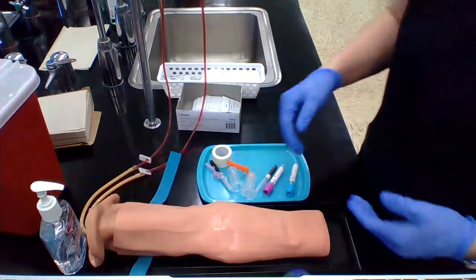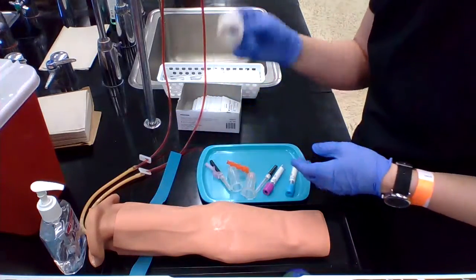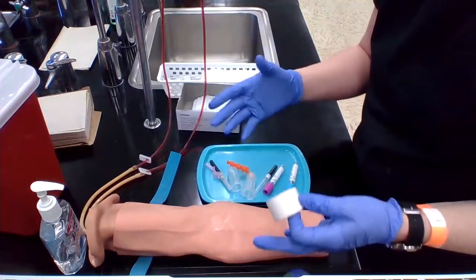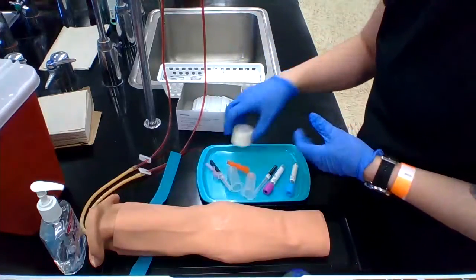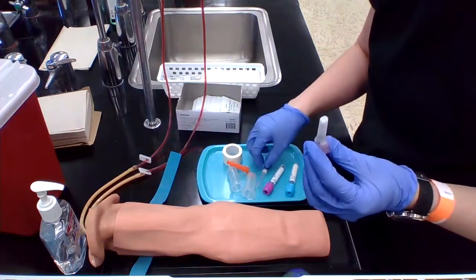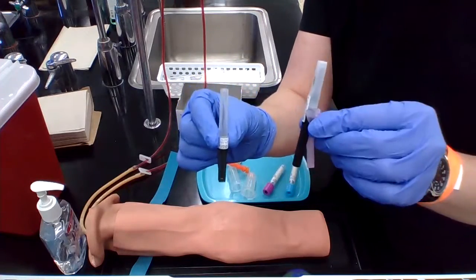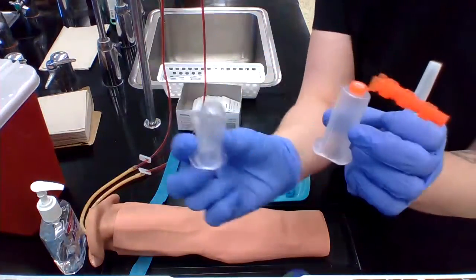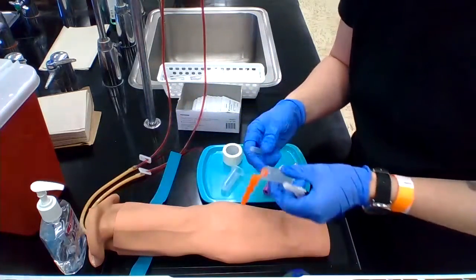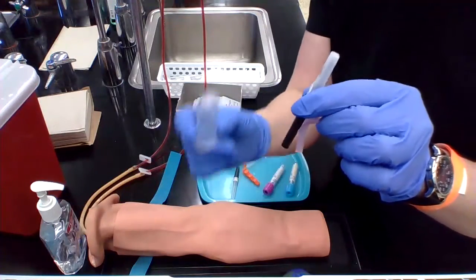While your patient is drying — remember the tourniquet is off at this point — you're going to want to assemble your materials. I like to take a piece of tape and have it ready on my tray before I do the draw, so it's just there and ready. You're going to want to get your needle and your vacutainer holder ready. These are two different types of needles — one has a safety, one doesn't. And here are two different types of holders — one has a safety, one doesn't. Either your holder or your needle needs to have a safety device.